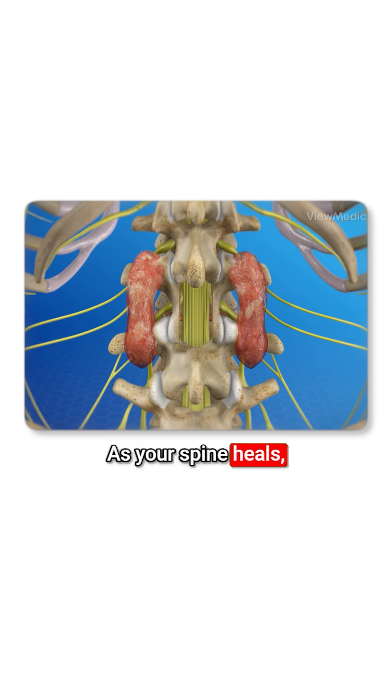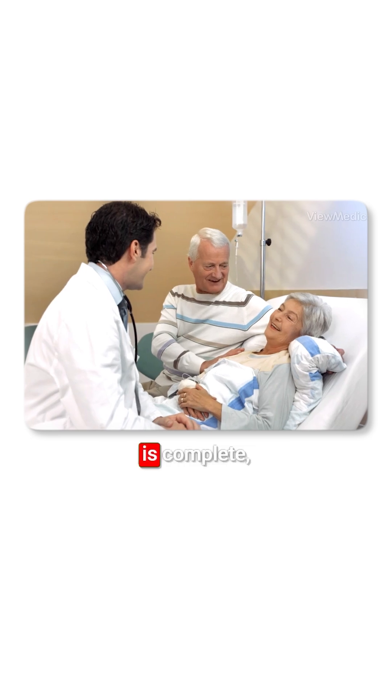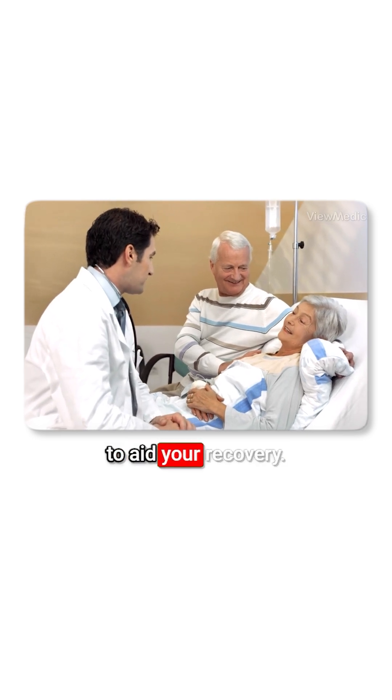As your spine heals, the graft material will grow to create a permanent fusion between your vertebrae. When the procedure is complete, your incision is closed. Your surgeon will provide instructions to aid your recovery.